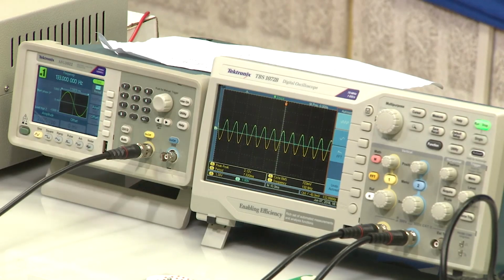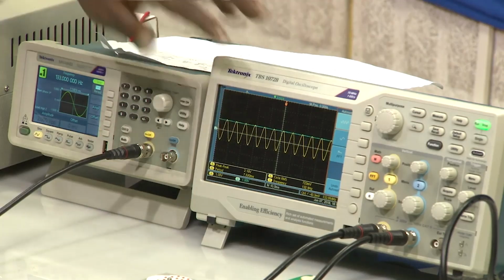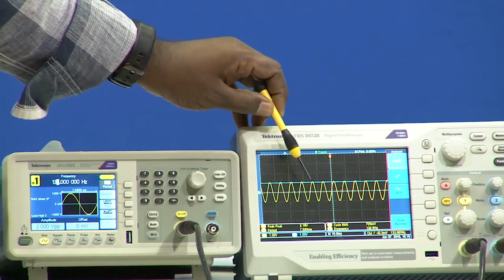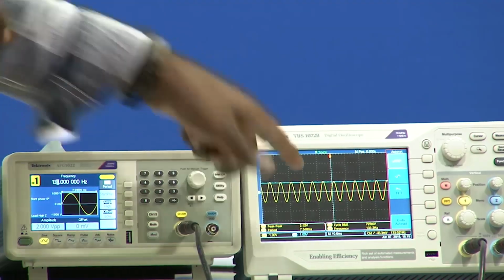We will connect this particular point to the cathode, the sixth terminal in this case. So this is my output, right. When we look into the oscilloscope, the input is yellow in color, and the output is sky blue in color. We can clearly see that. Now, the output is completely at the peak value of our input signal.